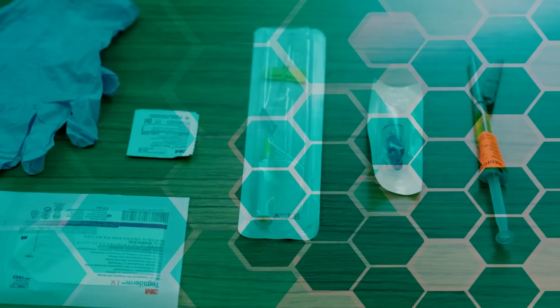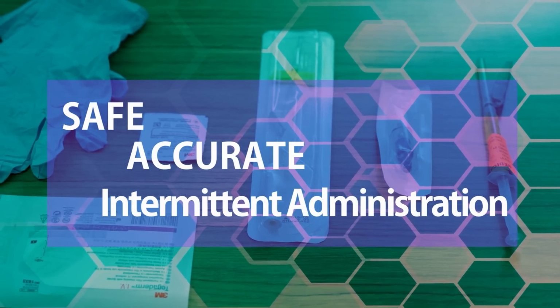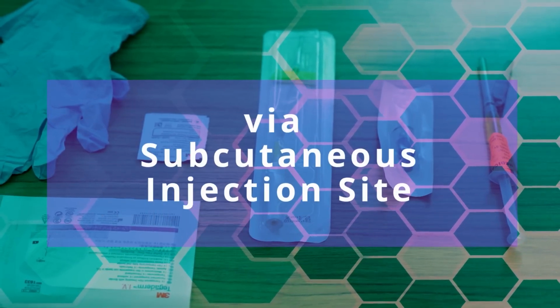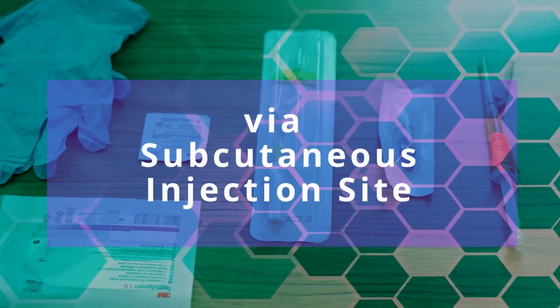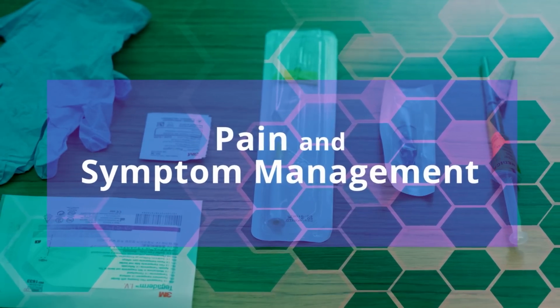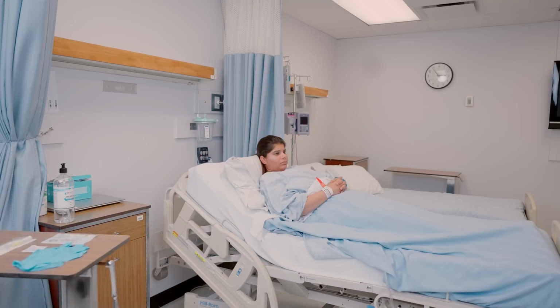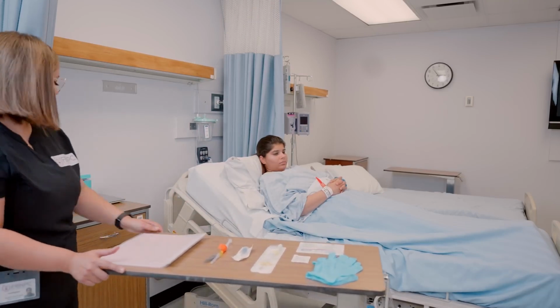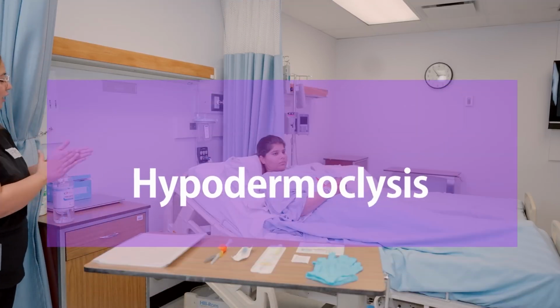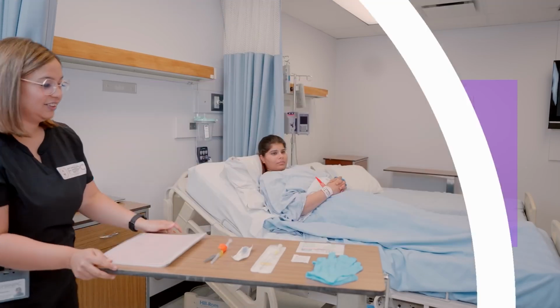Subcutaneous butterflies are inserted for safe, accurate, and intermittent administration of medication via subcutaneous injection site. Primarily, this is used in palliative care population for pain and symptom management when the other routes are not possible. We can also administer fluids through subcutaneous route, and that is called hypodermoclysis. This is one of the important topics tested in NCLEX.